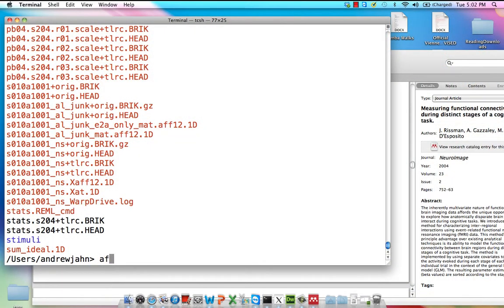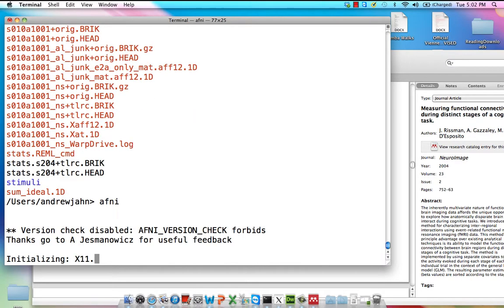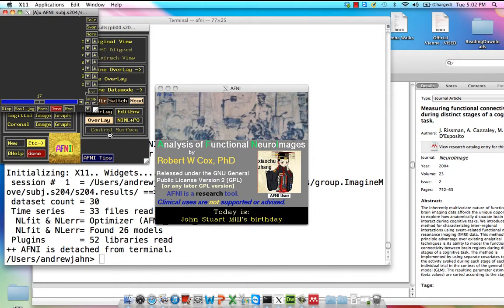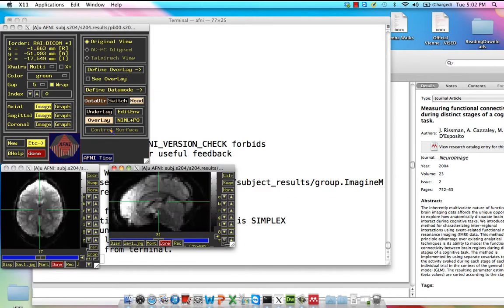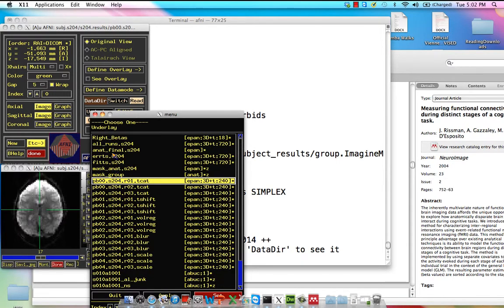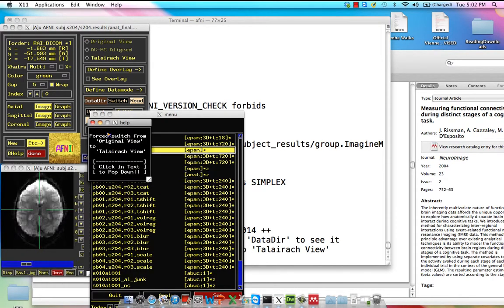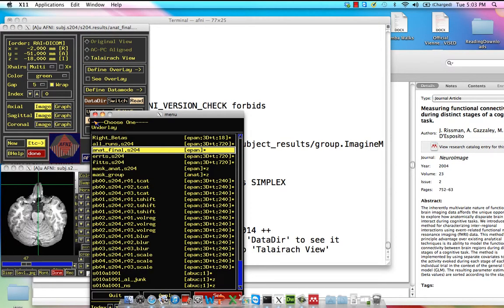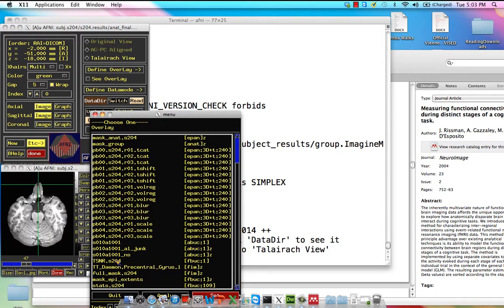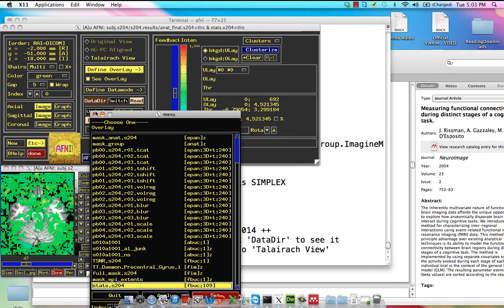The first thing we're going to do is open up this statistical data set, just to show you what it looks like. We have our anatomical image and we also have our statistical data set.